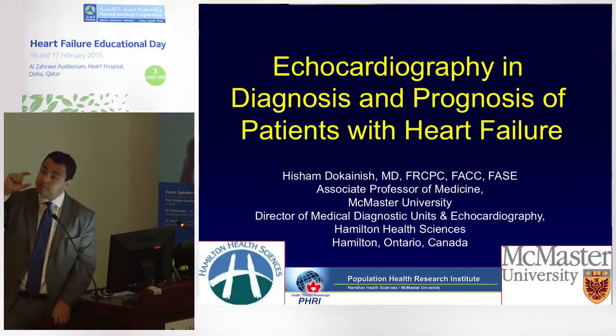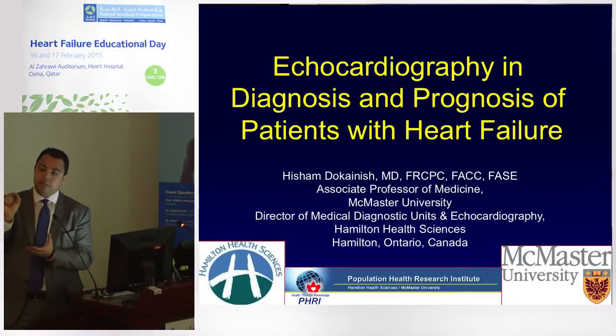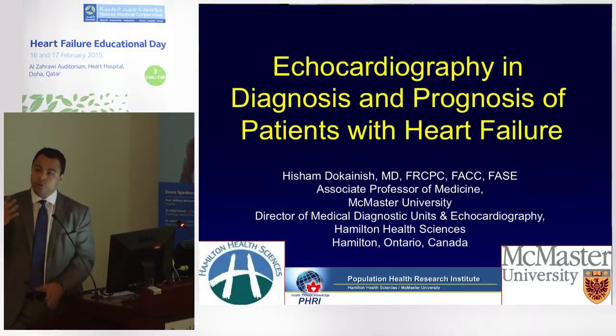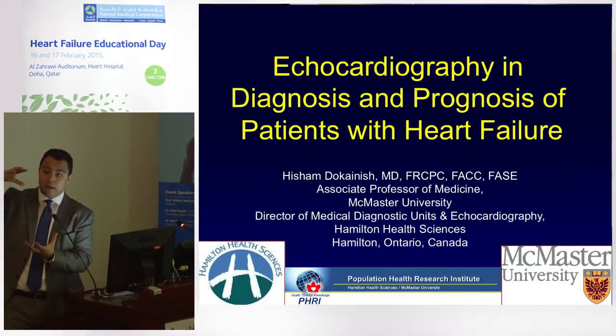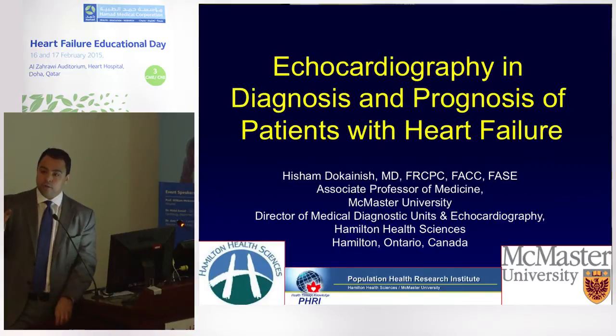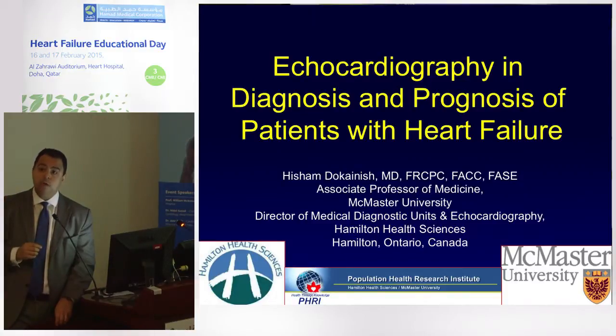That's recommended. Tissue Doppler is the velocity of the longitudinal motion. The problem with these measures is it's just one axis of the heart. You can have RV dysfunction but have a normal TAPSE or systolic velocity, or an RV S prime, tissue Doppler RV. So we tend to do both TAPSE, tissue Doppler, and fractional area change of the right ventricle. Fractional area change is the difference in RV diastolic area and RV systolic area divided by the RV diastolic area. So it's an area fraction change, if you will, of the RV. Greater than 35% is normal. So we use those three variables plus visual assessment to come up with a right ventricular assessment. So as with diastolic dysfunction, it's a multi-parameter assessment that's going to give you the most accurate interpretation.